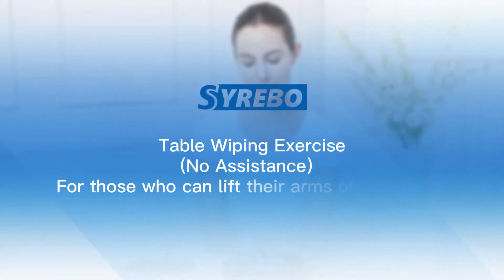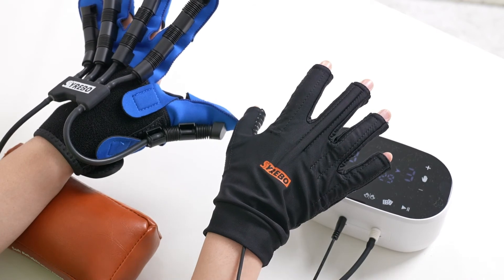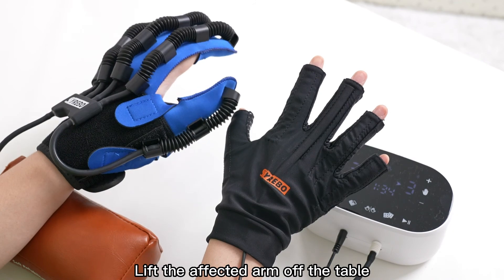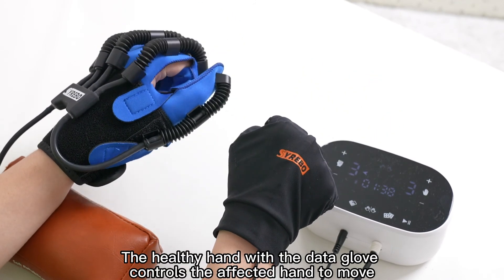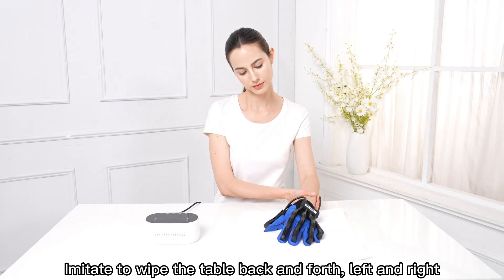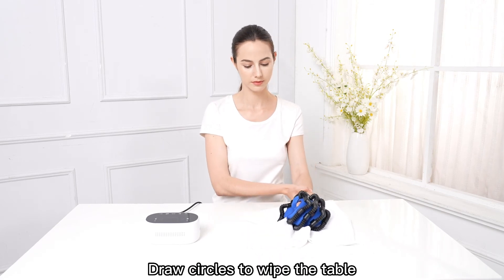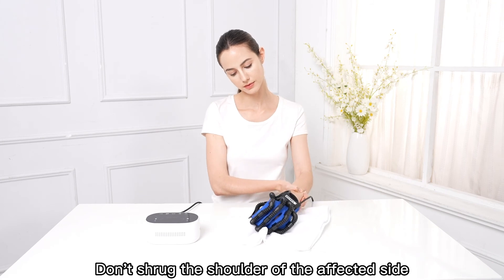Table Wiping Exercise with No Assistance — for those who can lift their arms off the table. Choose the Passive Training or Mirror Training Mode. The mode used in this video is Mirror Training Mode. Lift the affected arm off the table. The healthy hand with the Data Glove controls the affected hand to move. Imitate wiping the table back and forth, left and right, and draw circles. Do not shrug the shoulder of the affected side.